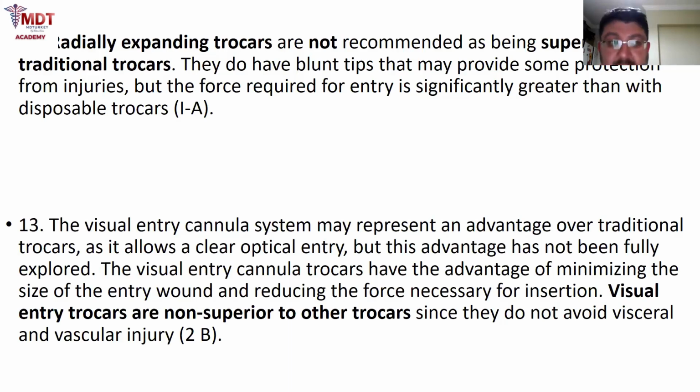Also, radially expanding trocars are not superior to the traditional trocars. They do not decrease the injury rates. I have never used this radially expanding trocar. I have also seen it, and it's not superior to the other traditional trocars. And also visual entry trocars are also not superior to other trocars.